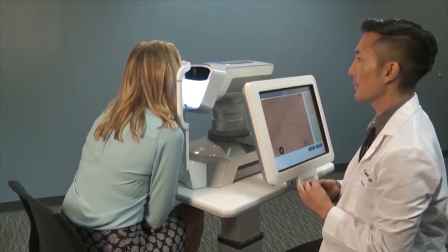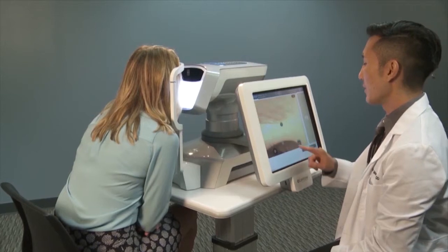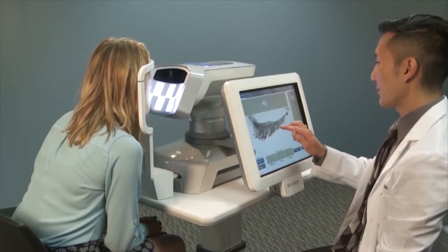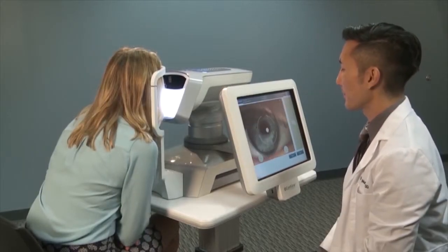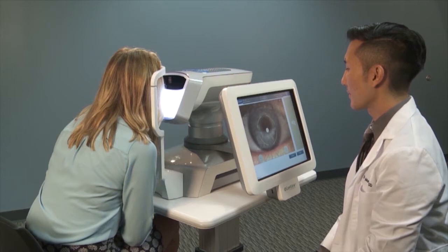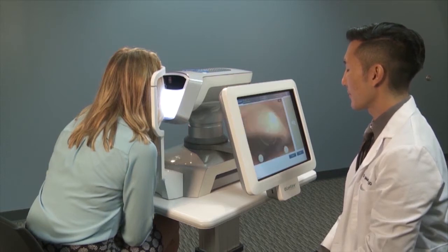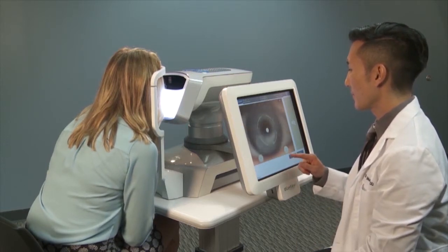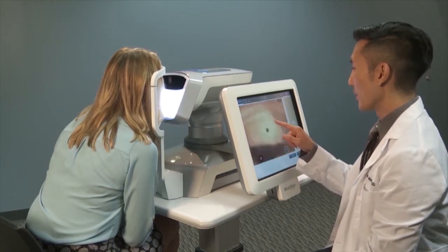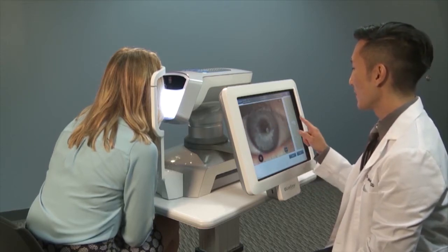Position the patient properly into the chin and forehead rest. Adjust the chin rest with the fluted roller to ensure the temporal canthus is aligned with the marks on the right and left side of the forehead rest. Instruct the patient to look in the direction of the orange fixation light inside the LipiView 2. Touch the right or left side of the lipid image capture screen for the eye to be imaged.